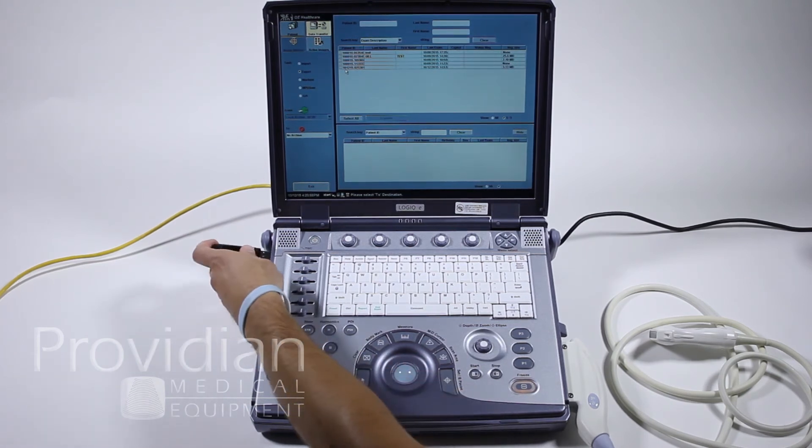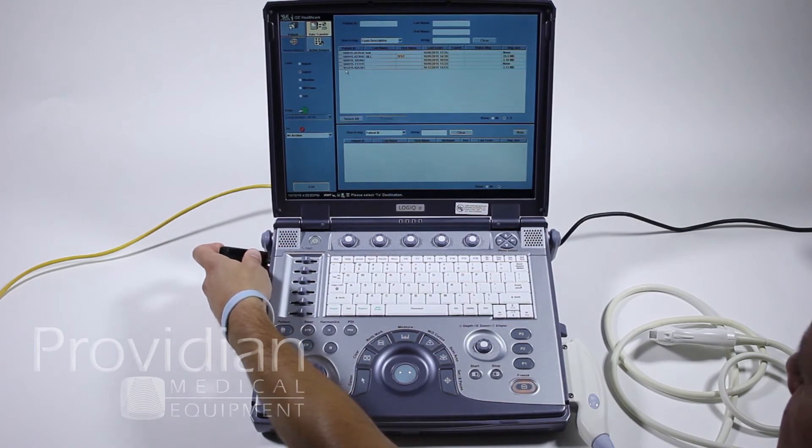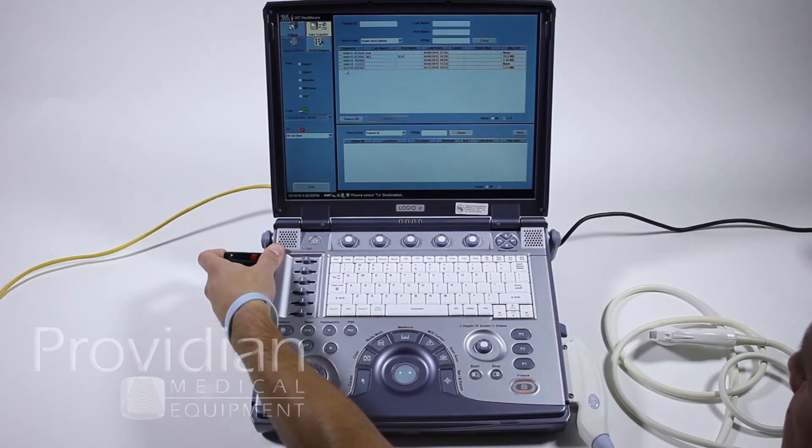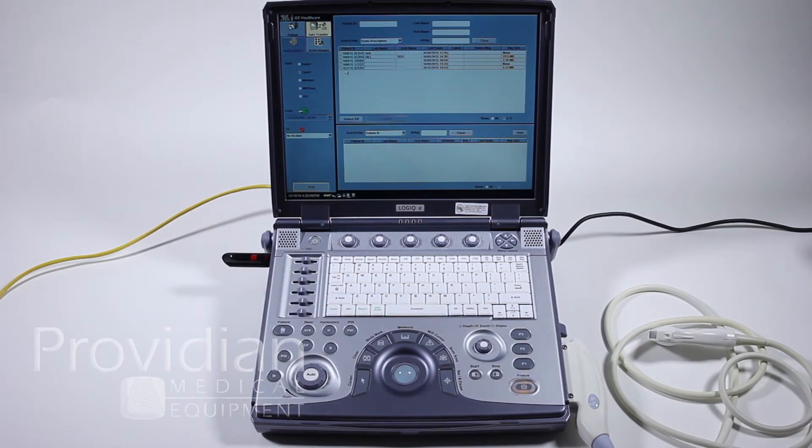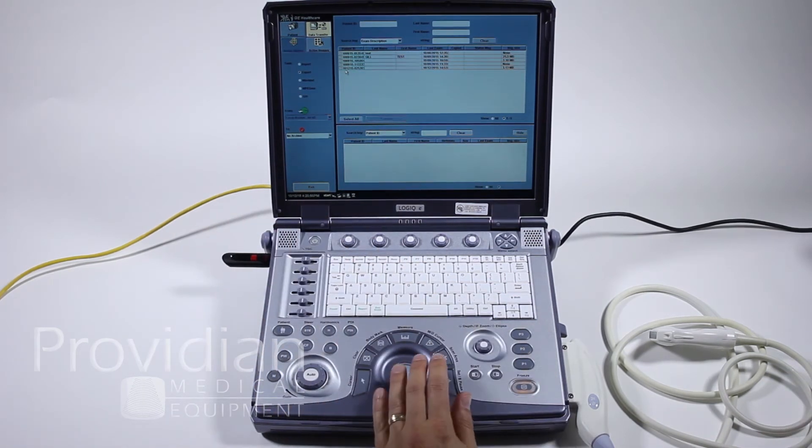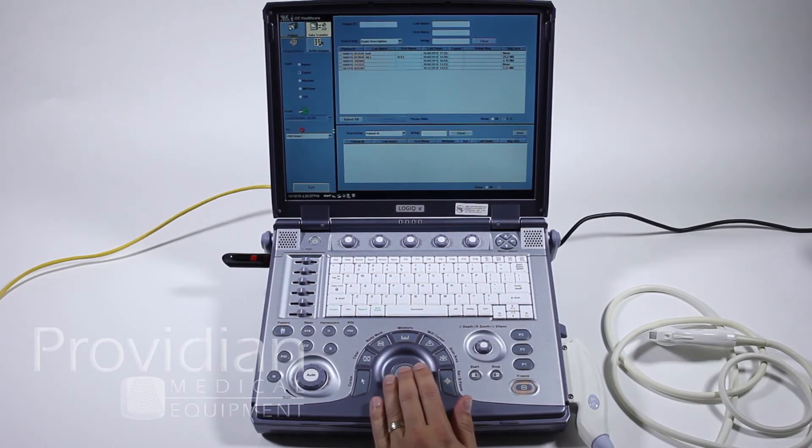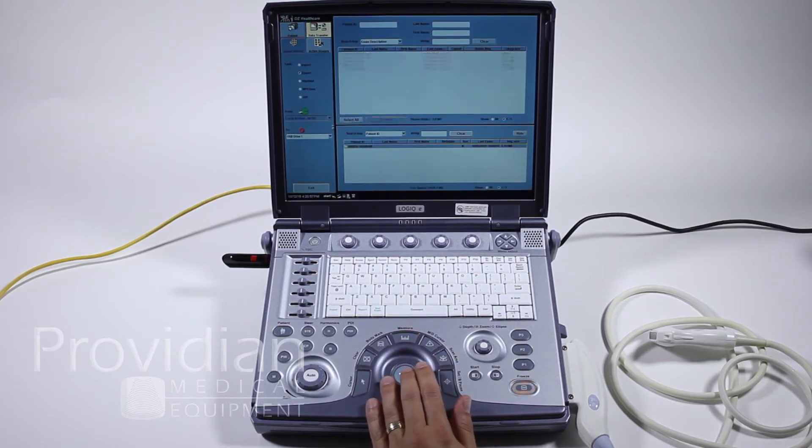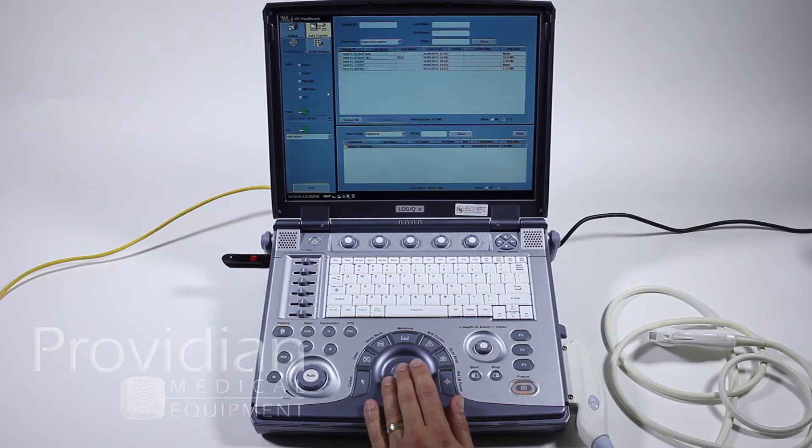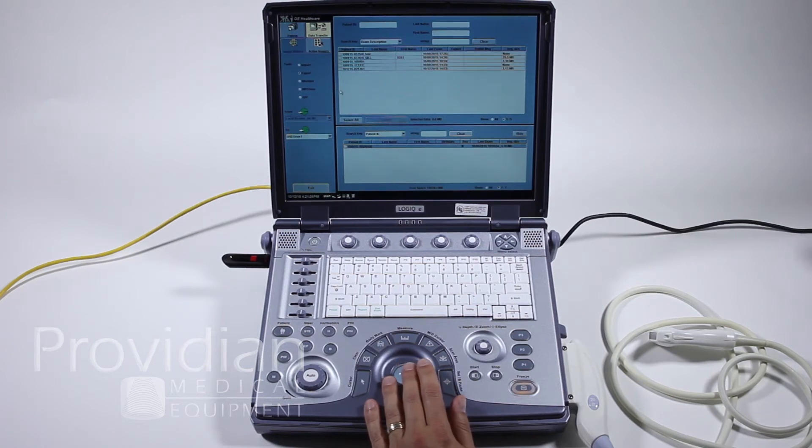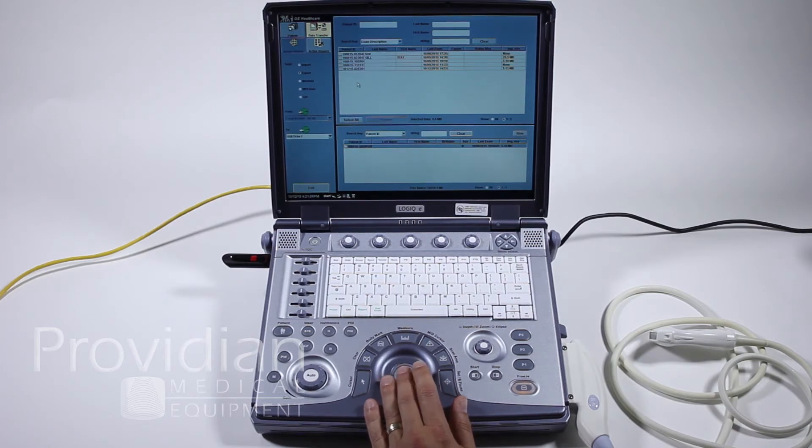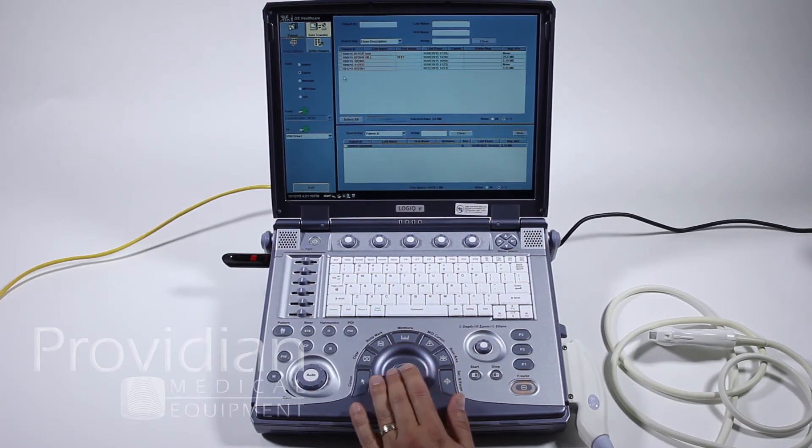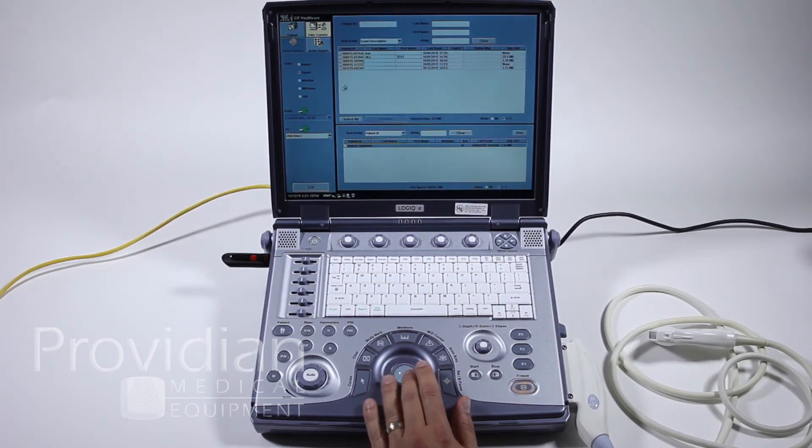As we showed before, how we'd export is we'd go to the data transfer, and here we would choose export. This is what's for the DICOM export. If I plug in a USB stick and click that export, I would be able to view these on a PC. However, they would all be in DICOM format, so it's not a PC-readable format unless you have a DICOM reader. There are free DICOM readers out there for you to use.